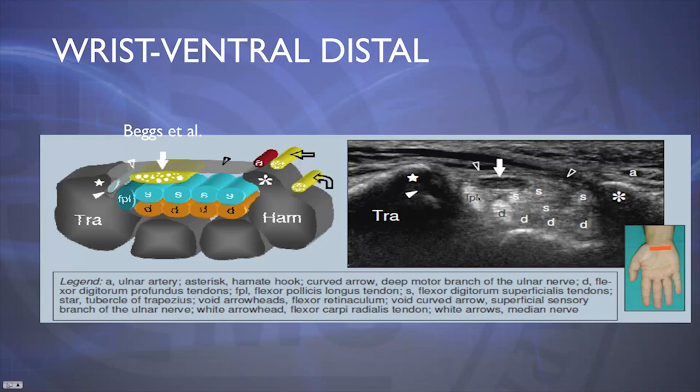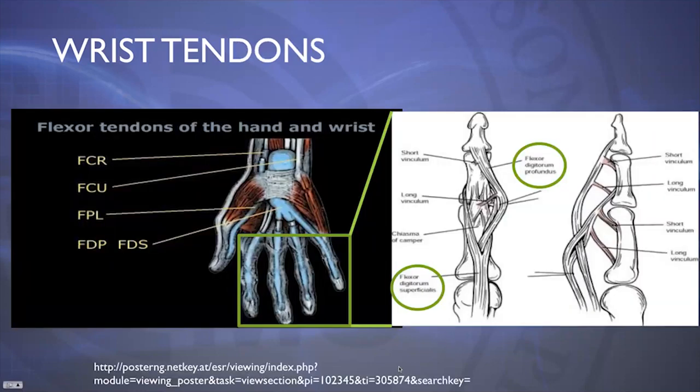The flexor tendons, as they move into the hand, into the wrist, and into the fingers, I just wanted to show this diagram here to show where the flexor digitorum superficialis and profundus went to. And in the fingers themselves, you can see the superficial layer is on the superficial aspect of the fingers on the bone, and then it wraps around the bones of the kind of distal phalanx here. Whereas the flexor digitorum profundus is going to be deeper to the superficial layer.